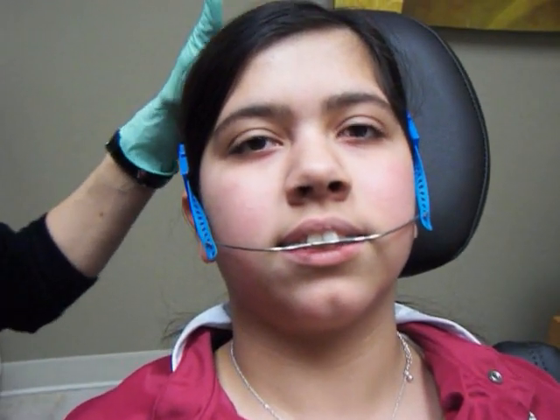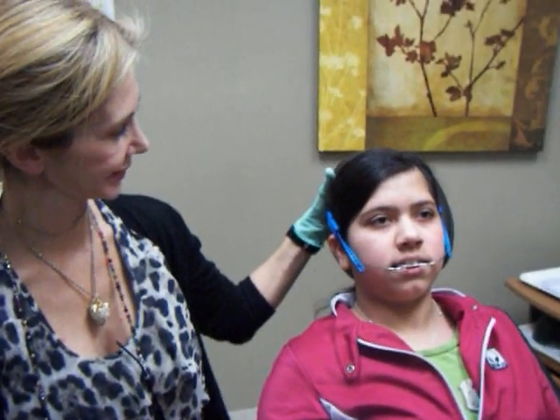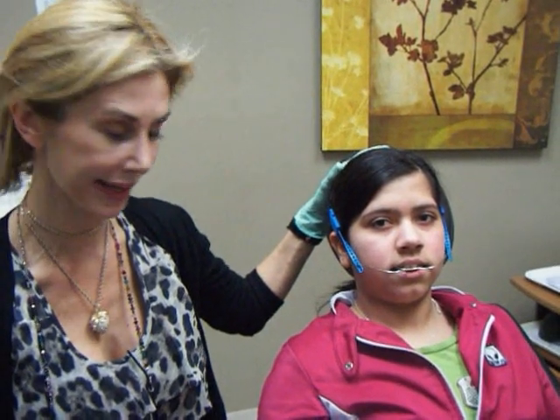That was amazing — well done. So now this is called a high pull or an occipital pull headgear, and it's stabilized on her skull, on the top of her head.